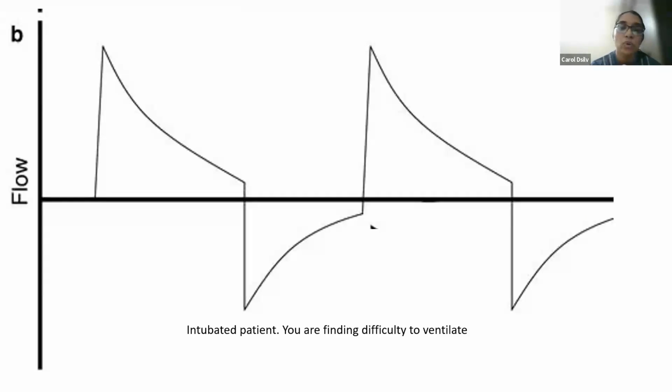Yeah. So now how do you confirm whether this patient is having an auto-peep or not? What is the maneuver you want to follow this up with? I'll do end expiratory hold. So I'm hearing expiratory pause, end expiratory pause, or an end expiratory hold. Okay. And what do you expect to see at the end of that? Why are you giving this end expiratory pause? To measure total peep. To see the intrinsic peep, ma'am. To find out intrinsic peep.